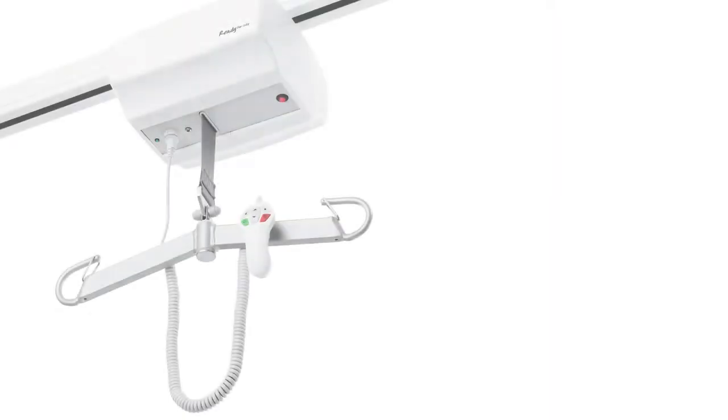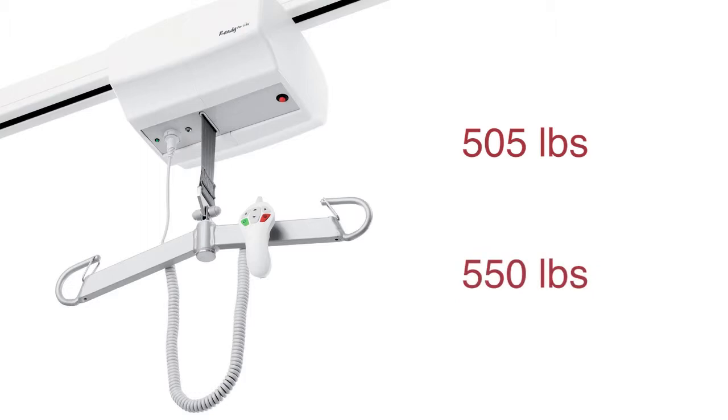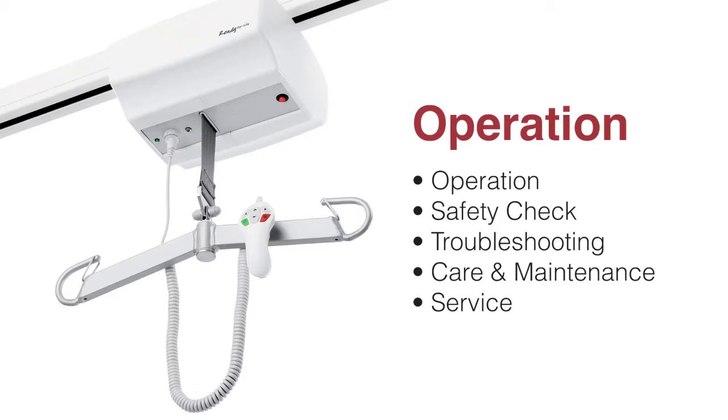We offer two RITA models which can transfer patients weighing up to 505 pounds or 550 pounds. In this video we will discuss the operation of the RITA including operation, safety checks, troubleshooting, and care and maintenance.